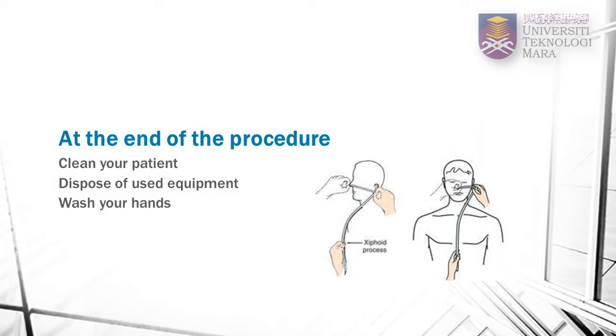In this video, you have learned the technique of inserting a nasogastric tube. At the end of the procedure, help to clean the patient's face and nose with paper towels. Dispose of used equipment, including gloves, into a clinical waste bin and wash your hands.